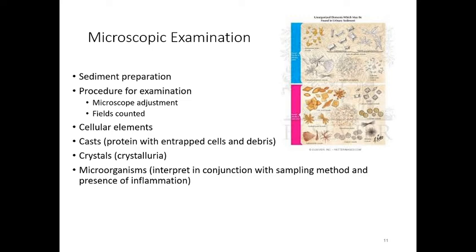And then we're looking for crystals. Crystals are formed when you have certain elements within the urine, like magnesium or phosphorus or calcium, and so they form little crystals, and those little crystals can eventually form into stones. So we have to be very careful. The crystals themselves make the urine very uncomfortable. When the animal urinates, they actually can feel discomfort associated with those crystals.